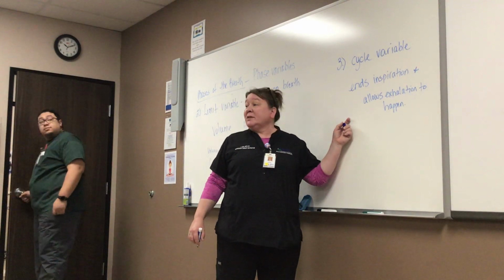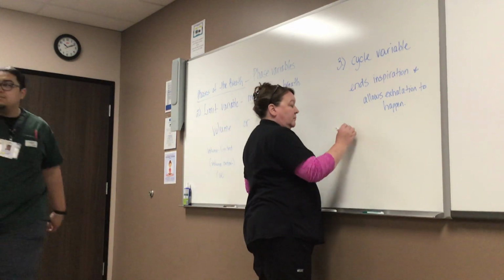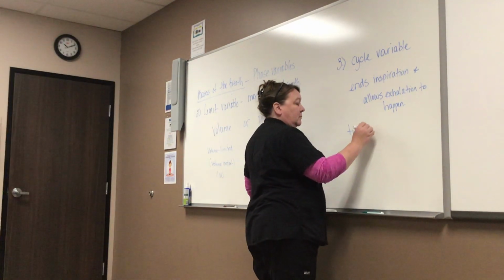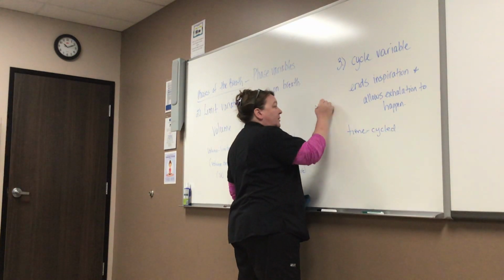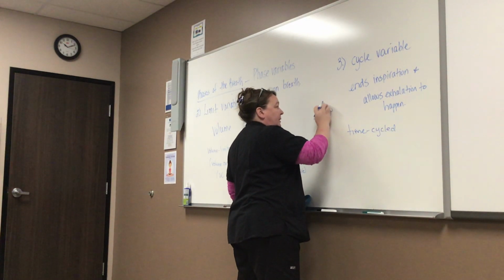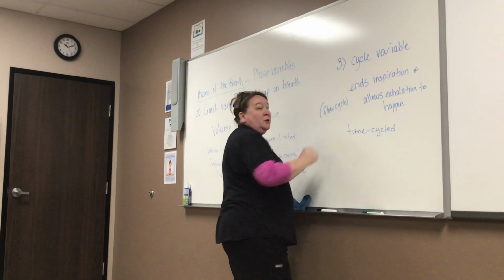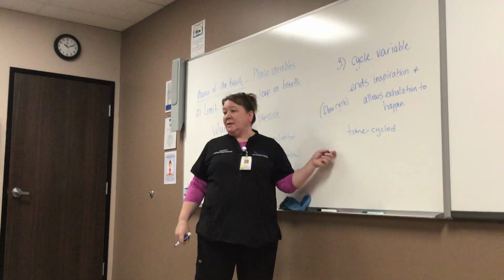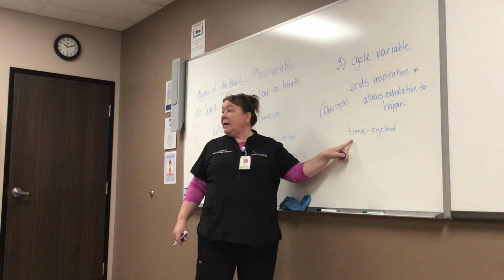So the most common one here is time cycled. There's also flow cycled, but we're not going to talk about that one today. You won't see volume cycled or any other crazy one mentioned in the book. Time cycled means what? When the inspiratory time is up, the breath ends.